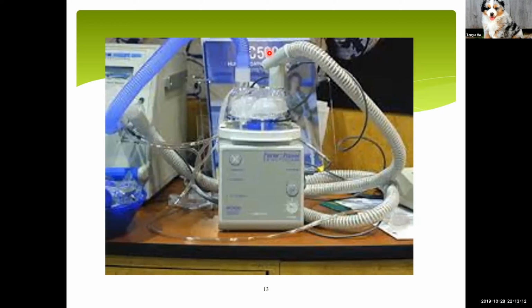Okay. Here's a picture of a passover humidifier. So you can see here, this is a heat, like I like to call it a hot plate. It's down here, it's like a hot plate. And then here's a simple reservoir type chamber right here. And you can see there's corrugated tubing here and here. And so the gas is going to flow in one side and then flow out the other side. Okay, and that's how it works. That's a simple reservoir passover humidifier.